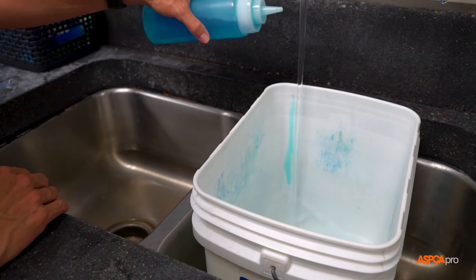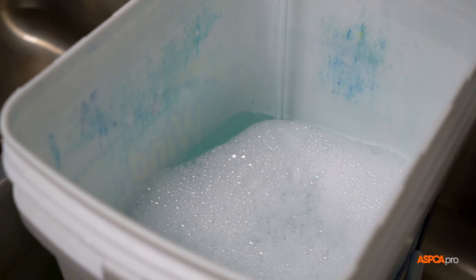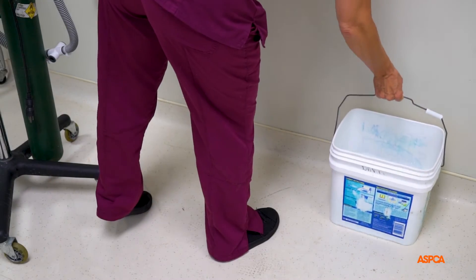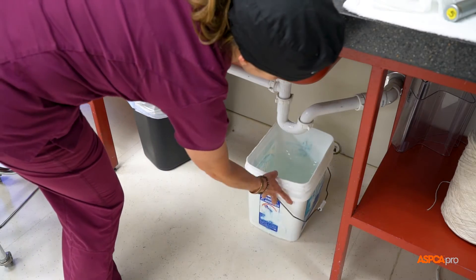To make this process more efficient, before surgery begins, prepare a two-gallon bucket of soapy water using dish detergent and place it in the recovery area. Then prepare a two-gallon bucket of disinfectant and put it under the prep area's sink.